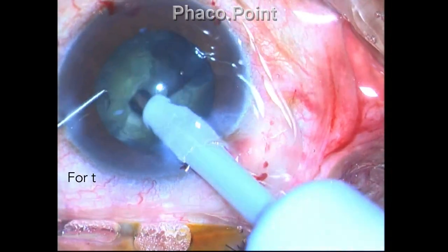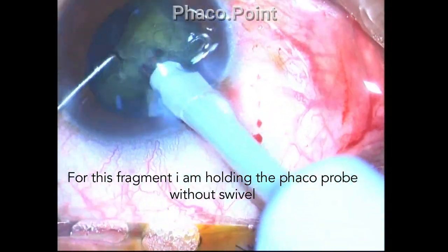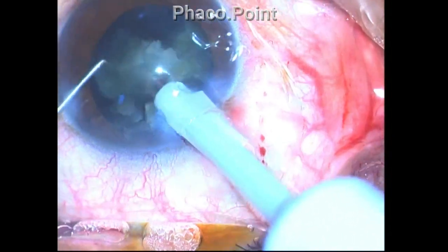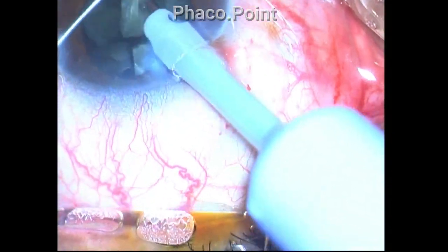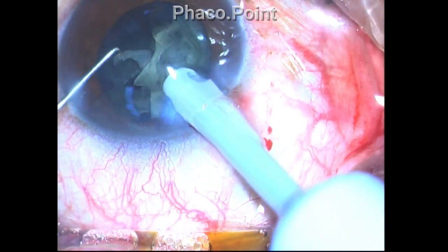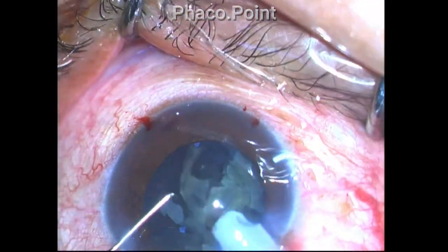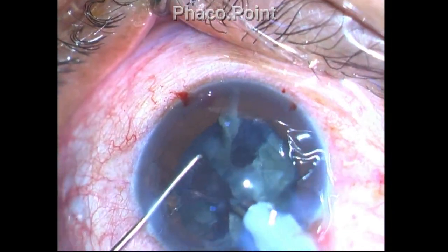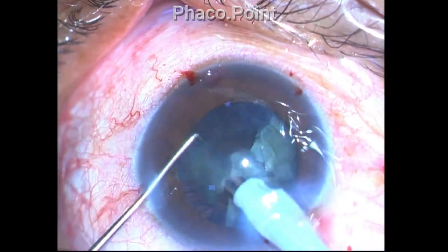Now for this fragment, I am not swiveling the phaco tip — I am just holding it straight, even though the followability is good. We depend on the flow that occurs in one plane only, and sometimes pieces that are not in the plane of flow do not get aspirated.